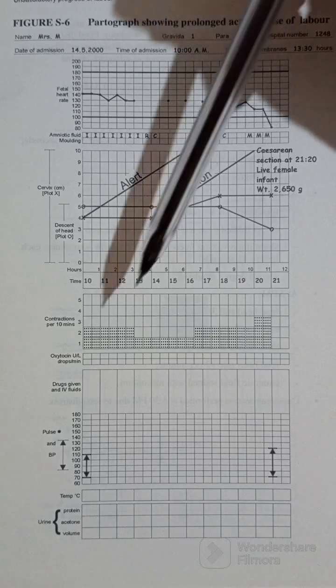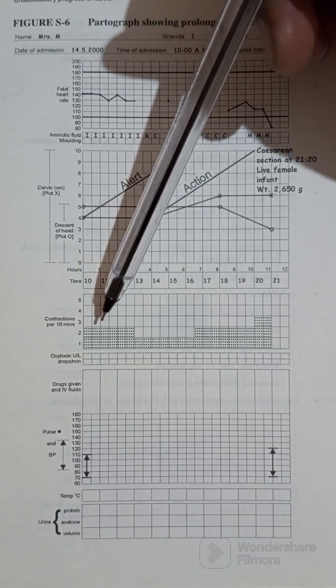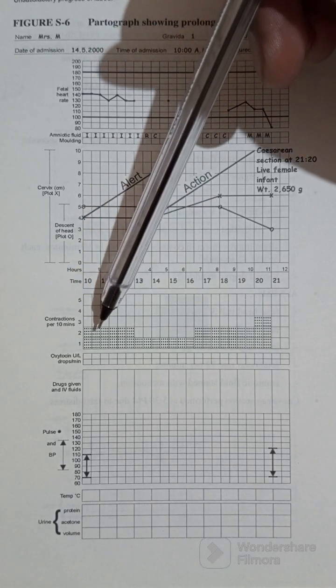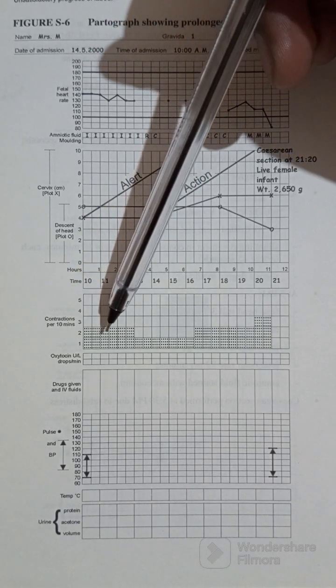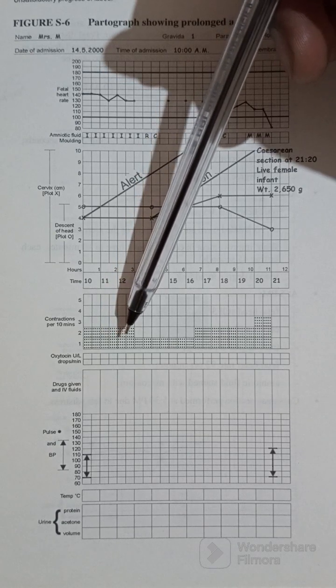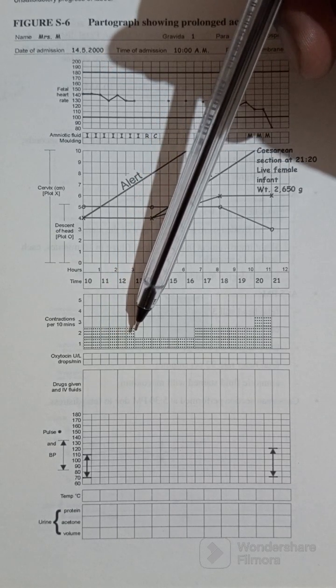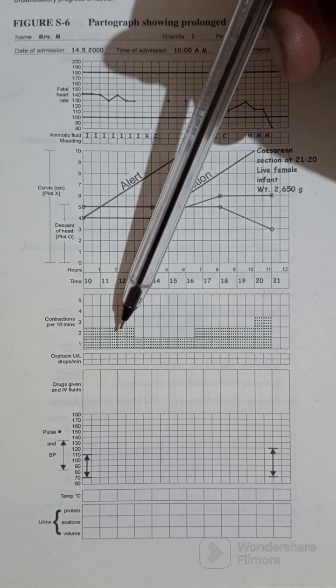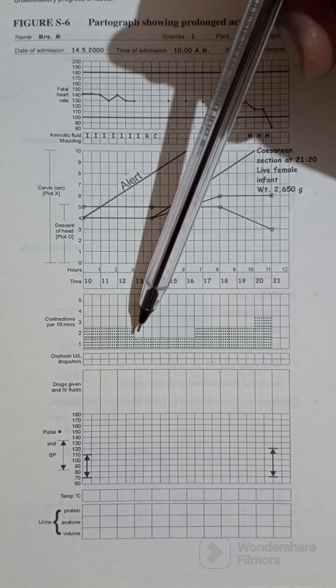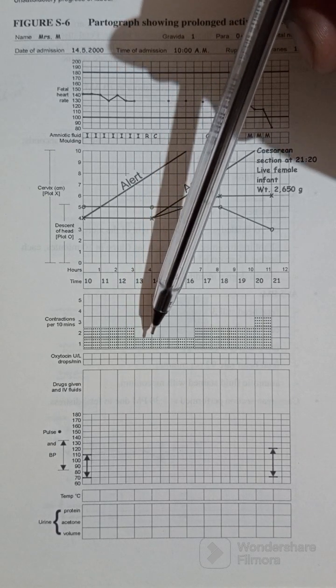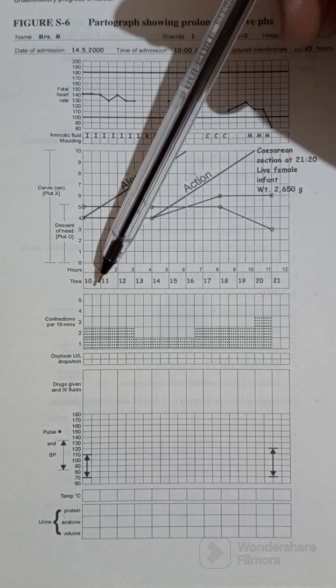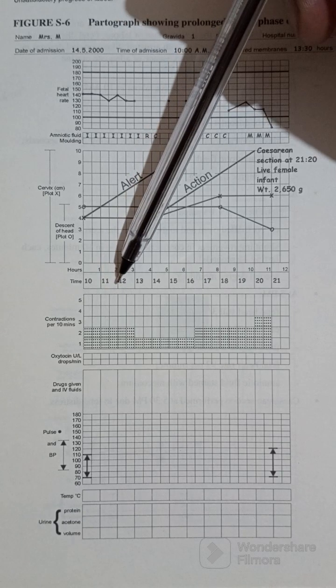Then four hours later, the contractions were two contractions and they were mild contractions at this time. Then every 30 minutes they started doing, they were still doing contractions, they were still assessing contractions and they were still mild.